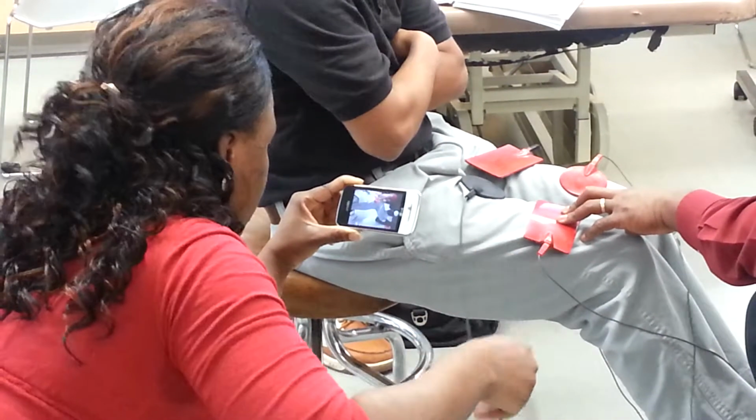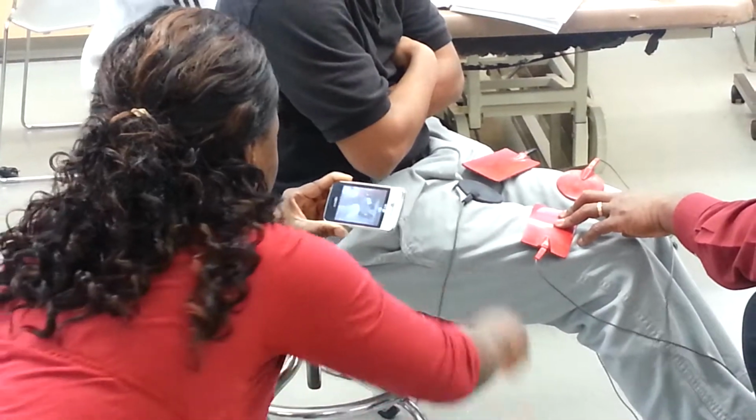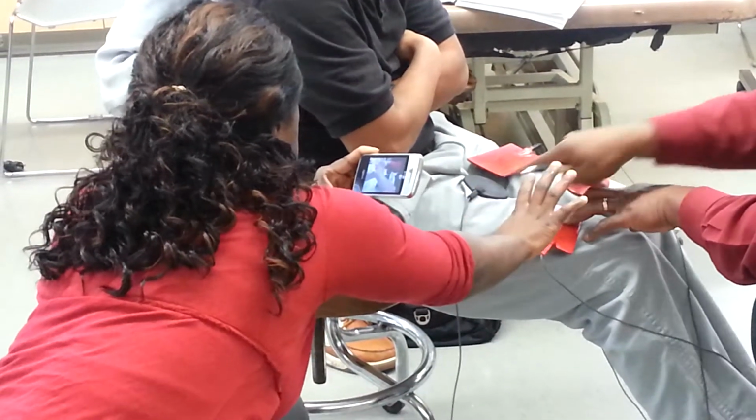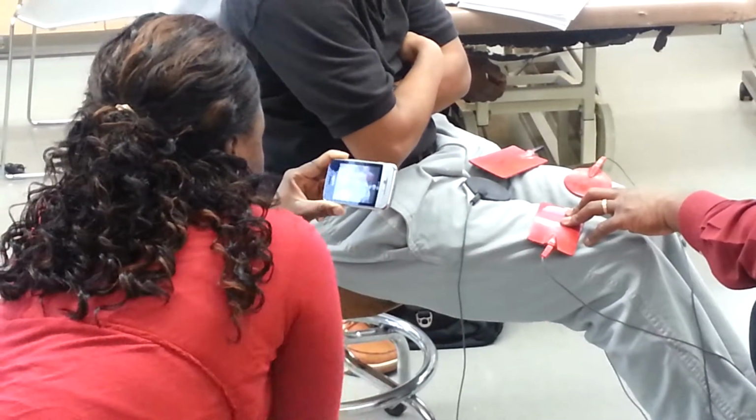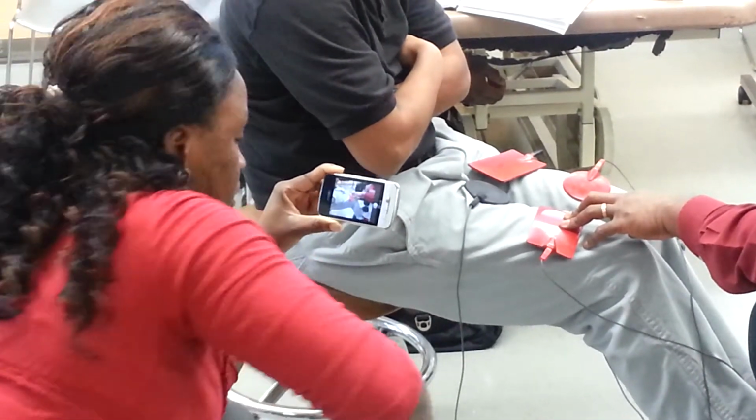So if you are in different channels, one channel here and one there, here's a channel. If one is working, this one will be working too, and they both will come on. Okay. Now, what if I did this?